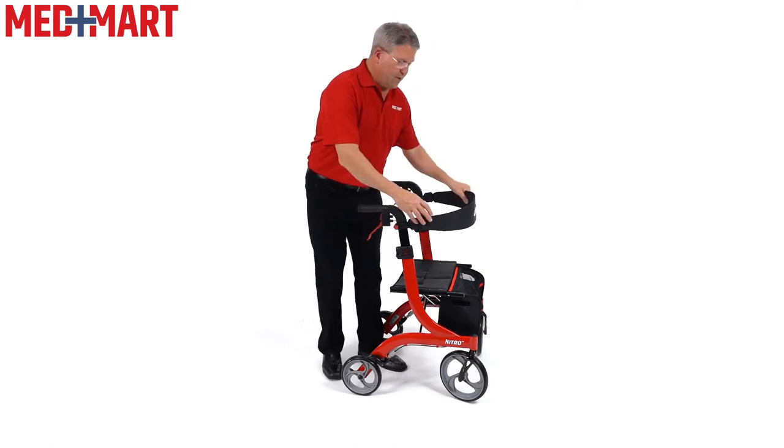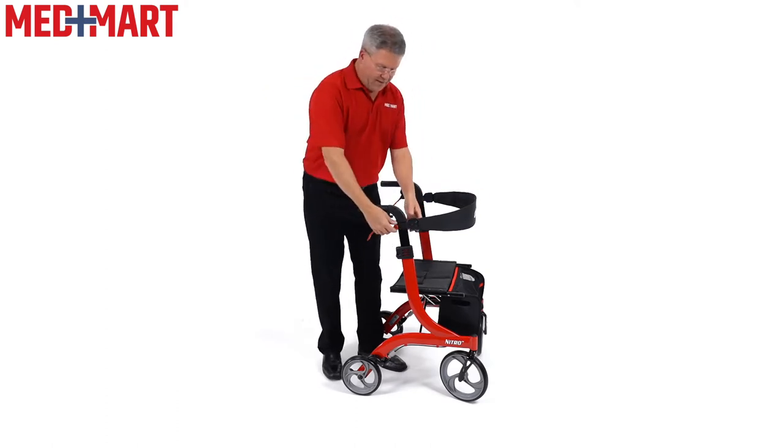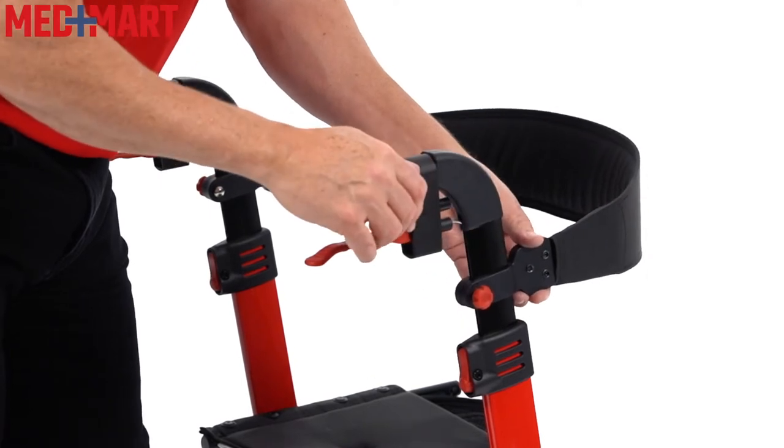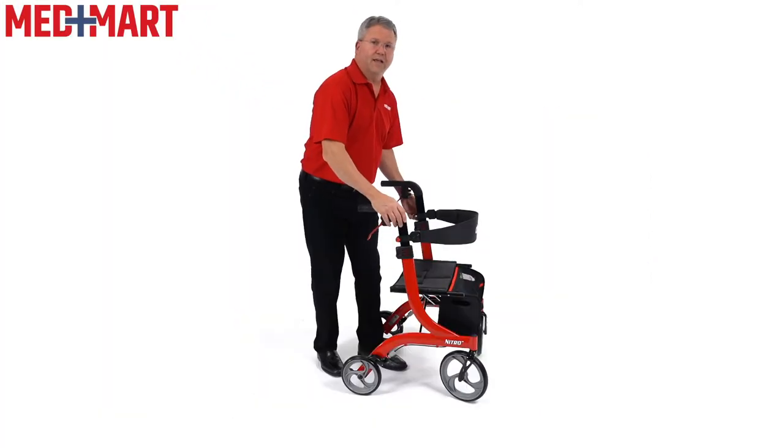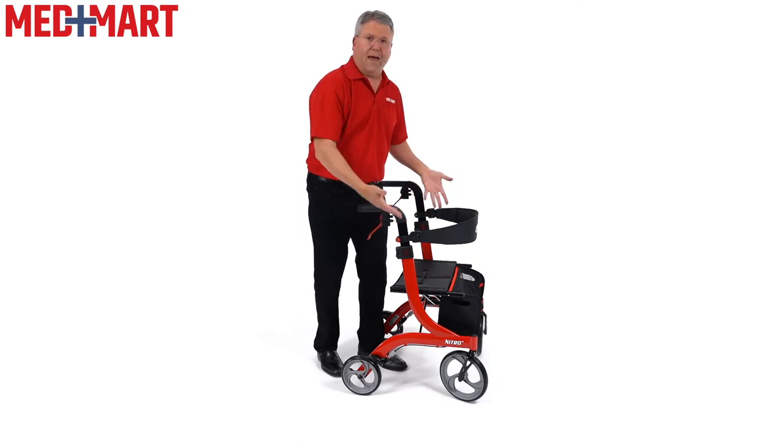If you notice that the backrest hits you in different spots, it's very easy to adjust. If you want a little more lower back support, just by loosening the mechanism you can easily adjust the back support on this as well.